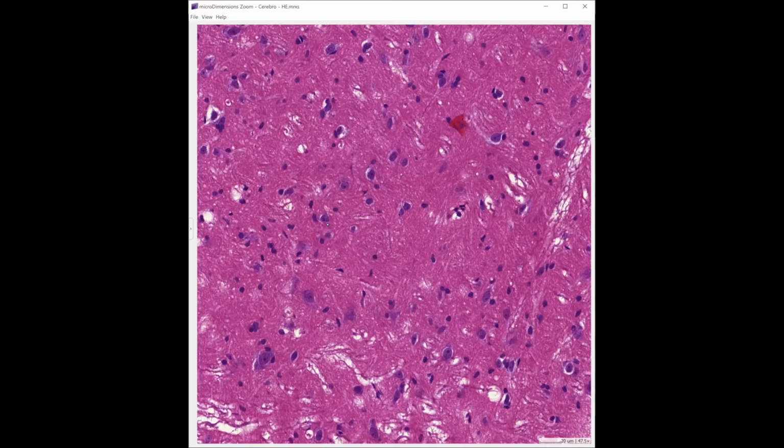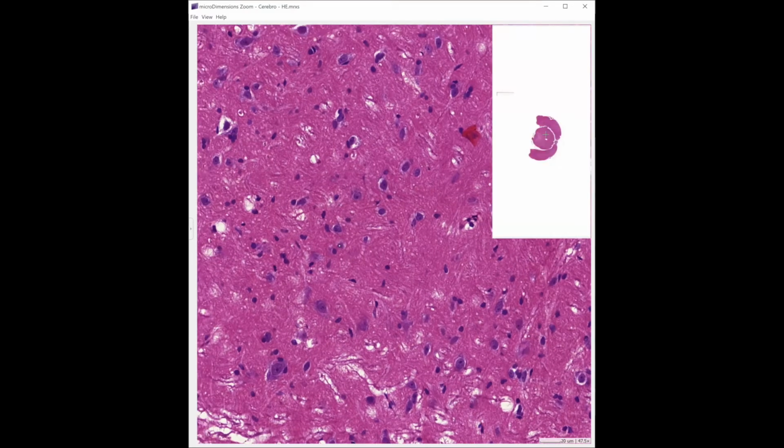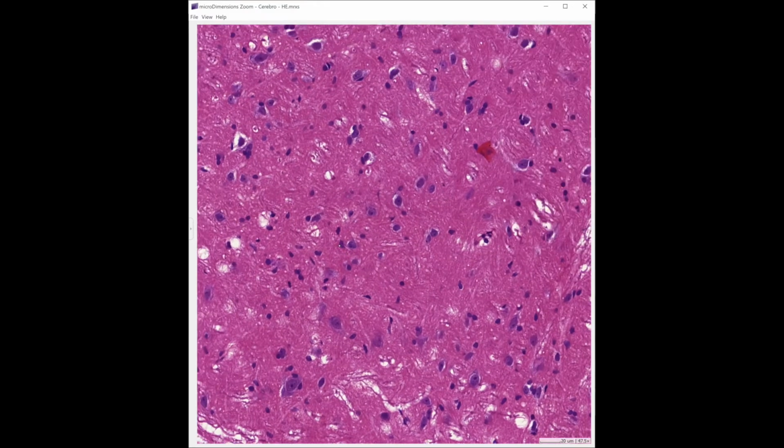So basically, he can put it side to side, and you guys can compare this in real time, the different tissue in a micro view of the healthy one and the unhealthy one. Cláudio, coloca os dois do lado só para a gente comparar, por favor.